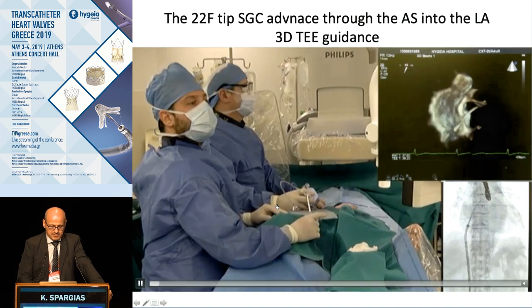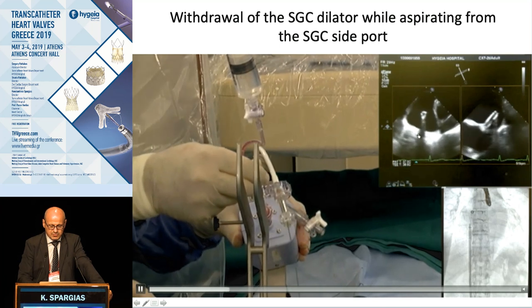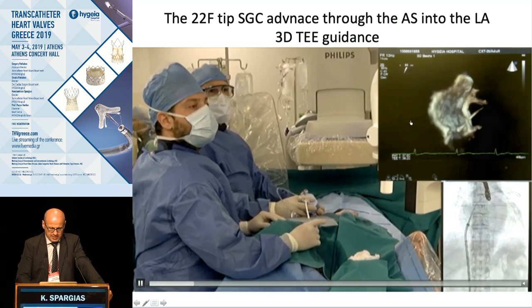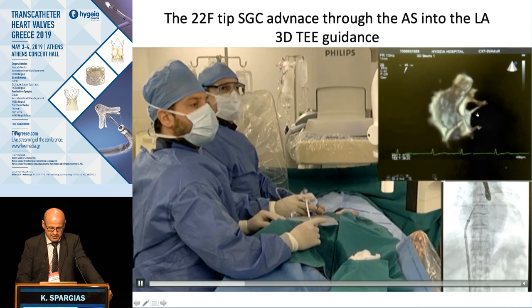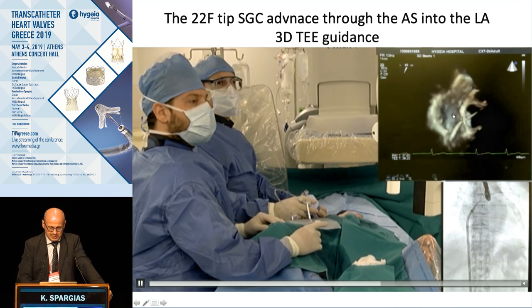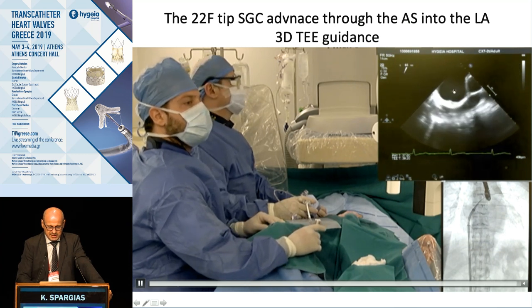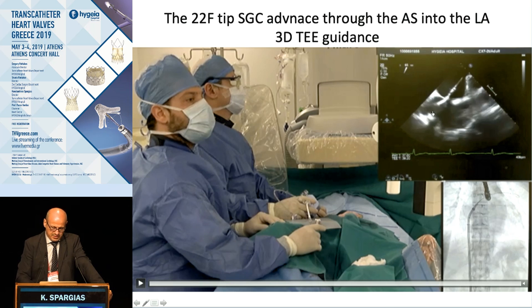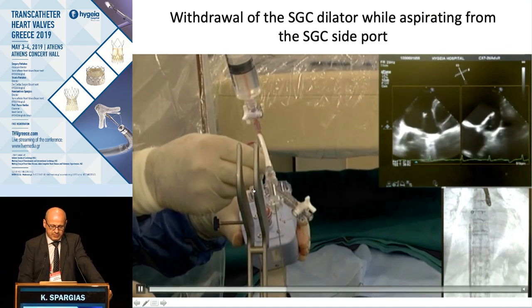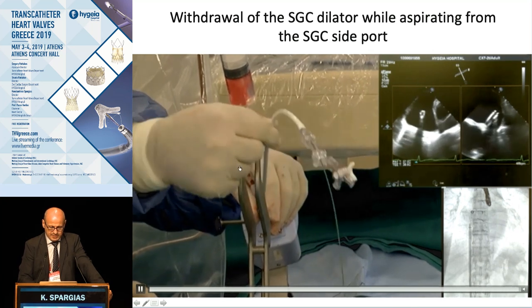For the MitraClip, the next steps are as follows. You advance the guide catheter first — it is now in the system and enters the left atrium. Initially you see the dilator, then you advance it through. The main guide catheter comes to the septum and goes through. Watch carefully: the lines visible are from the dilator, and the thicker part is the main guide. Then remove the dilator of the guide catheter again with aspiration using a luer-lock syringe — there is a very high risk of sucking in air here, so be very careful.